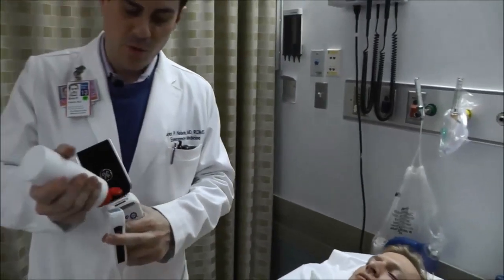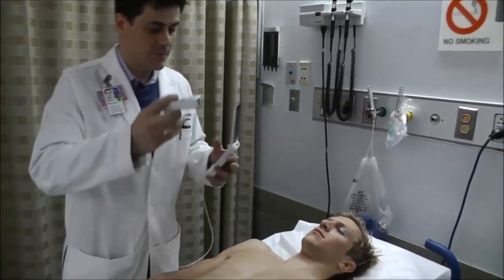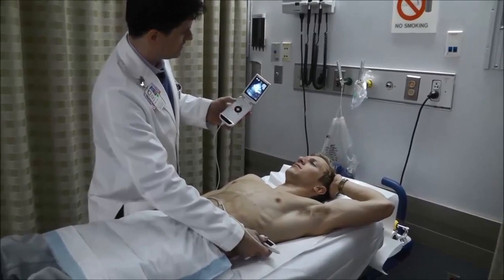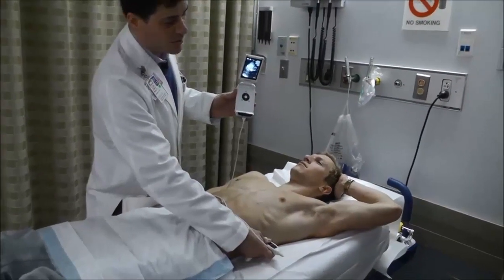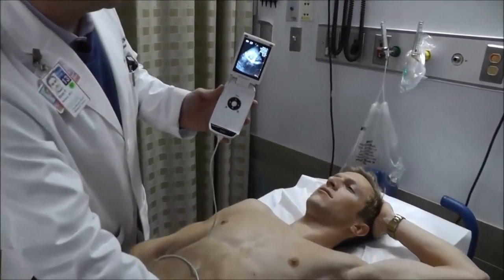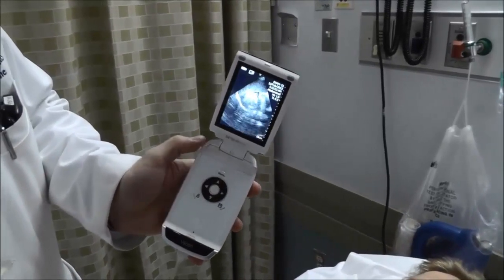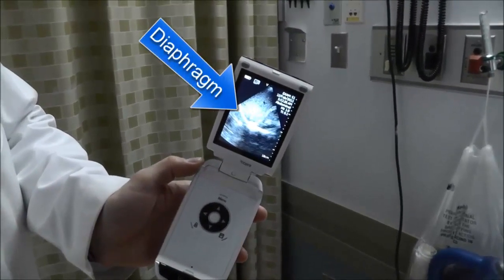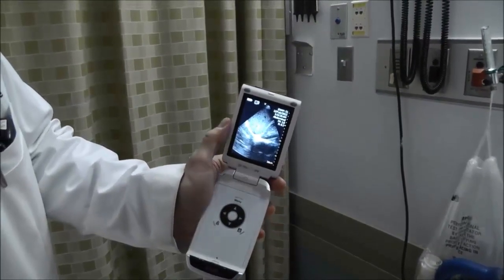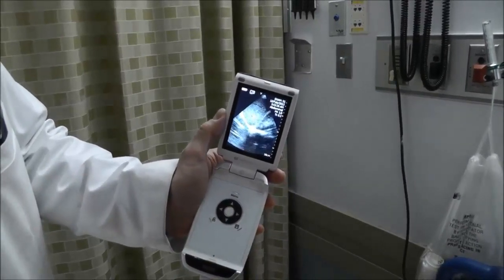Applying a bit more gel, we're now going to look at the lung for pleural effusion. We do that by going to the left side and finding the spleen. We're at about the level of the posterior axillary line, and we can see the spleen in the near field on the top left of the screen. The diaphragm appears as a bright white curved line. Above the diaphragm is where we would see a black stripe indicating pleural effusion, but in this case there is none.